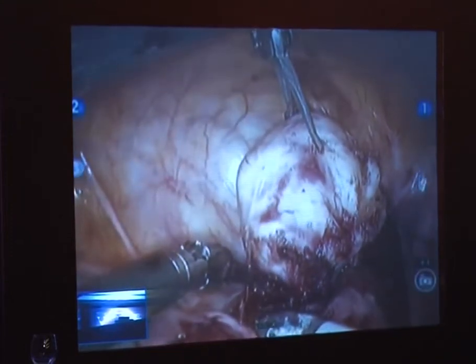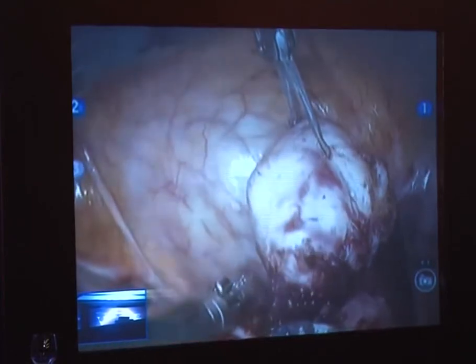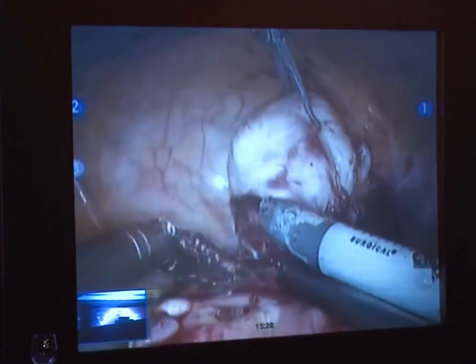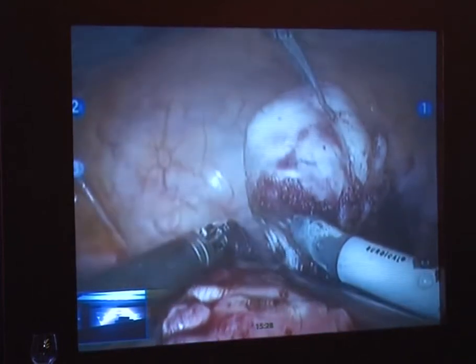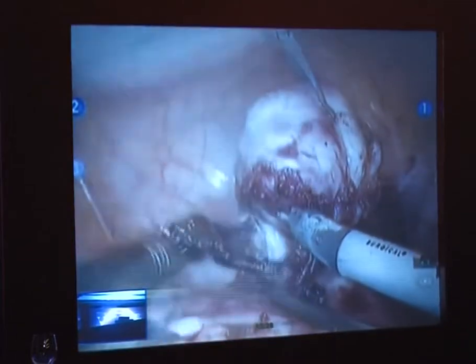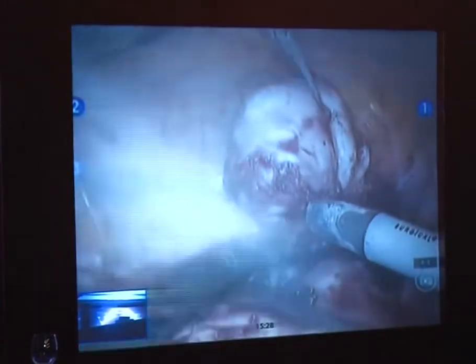We have a couple questions too, Arnie, if I may. That broad ligament fibroid that you removed, now that raw area, are you going to suture it up or stuff it up with Surgicel, or how do you handle that? If we think it's oozing, we can put some Surgicel in there. Right now we have a little bit of bleeding from this site, which I'm going to put some sutures in right here, and we'll sew this up and get that to stop bleeding. But this looked dry earlier, so we probably won't put anything in there necessarily.